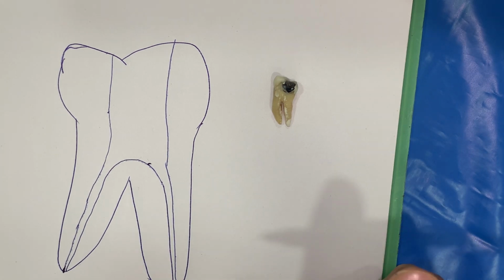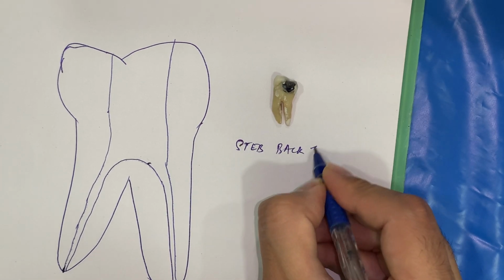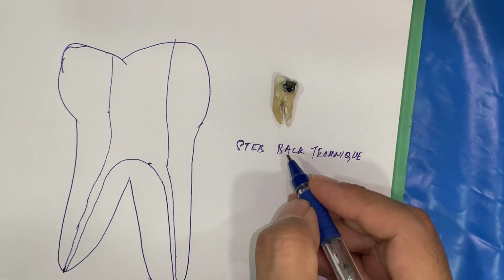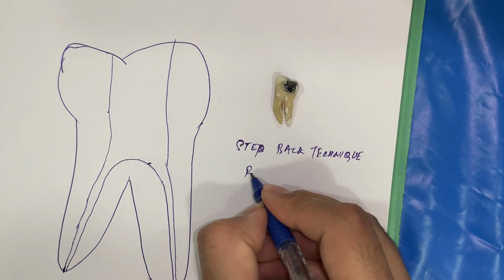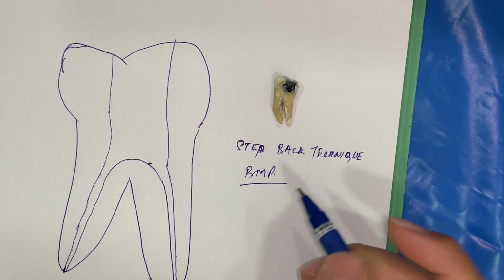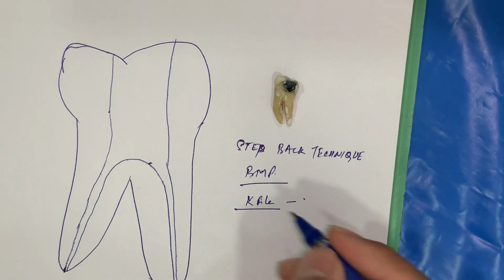Today we'll be talking about the step back technique. This will be the step back technique for the biomechanical preparation, or the BMP. The step back technique involves the use of a K file to complete the biomechanical preparation.